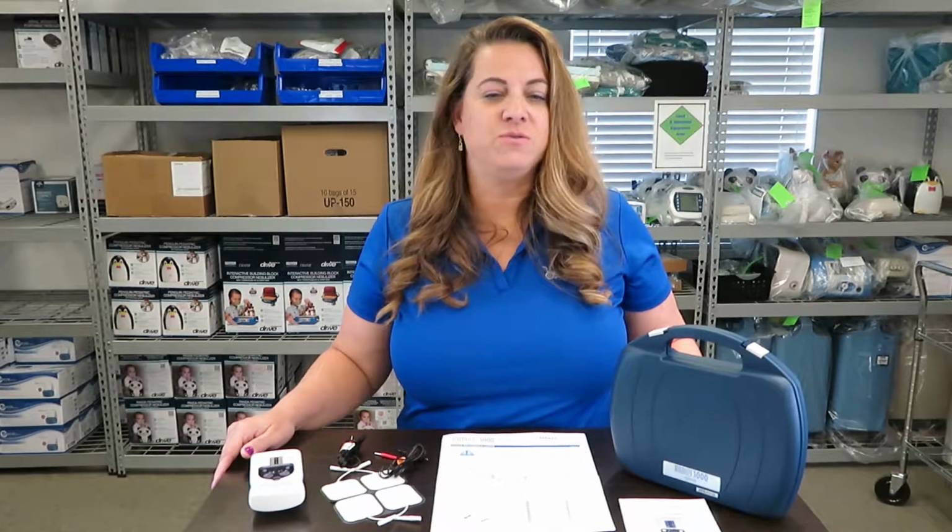Let's discuss how a TENS works. There's nothing magic about a TENS unit. It is intended to relieve pain. It sends comfortable impulses through the skin that stimulate the nerves. In many cases, this stimulation will reduce or eliminate the pain you feel.